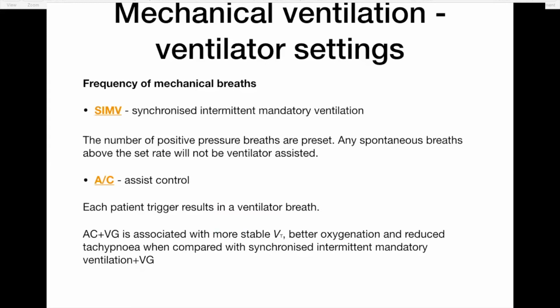Sorry, so SIMV ventilation stands for synchronized intermittent mandatory ventilation. In SIMV, we need to set a number of positive pressure breaths, and any spontaneous breath above the set rate won't be ventilator assisted.